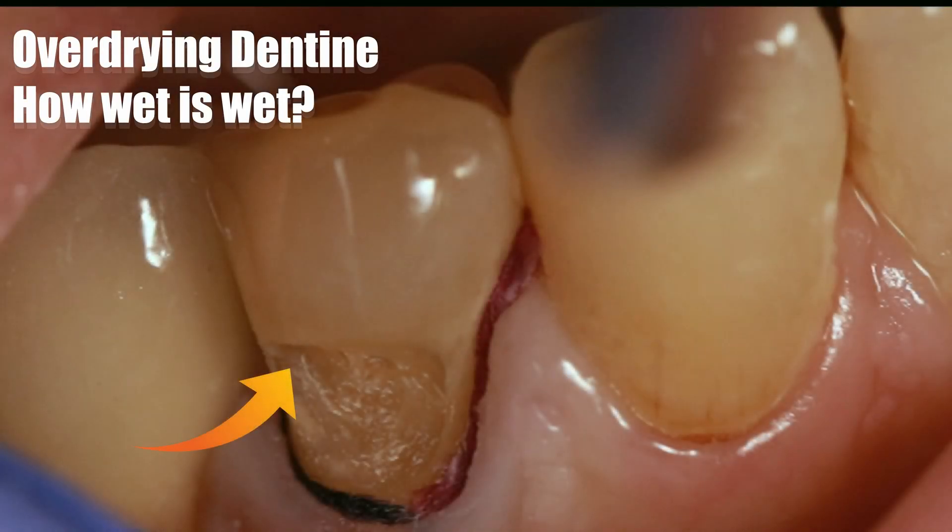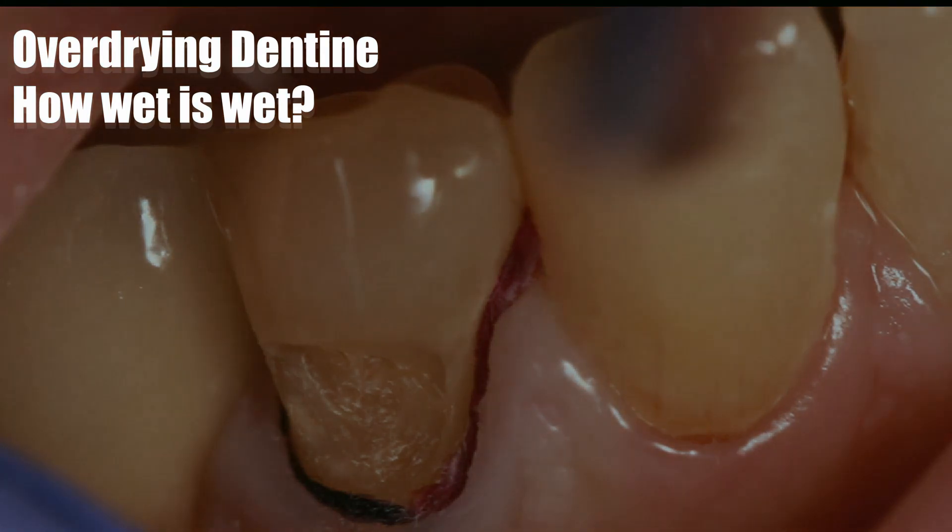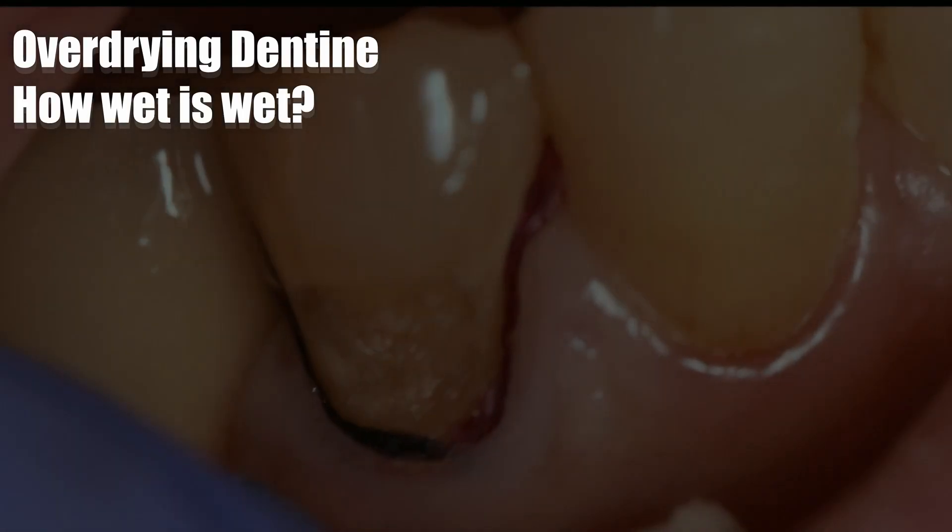If we freeze this frame and have a look at the surface of the dentin after all of this drying, you can clearly notice what overdried dentin looks like. What you have to do to avoid getting this structure is simply to stop drying just before it starts to appear, because of the collapse of the collagen network which occurs when you desiccate the dentin. If you want to bond to something like this, you are actually bonding to a flat surface.